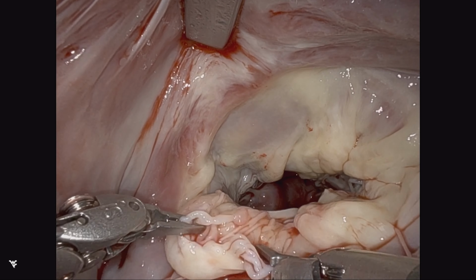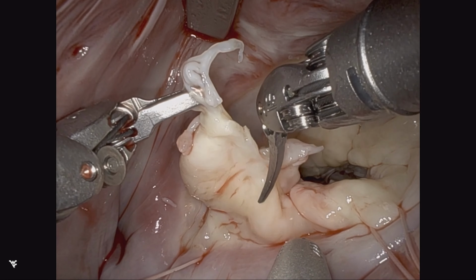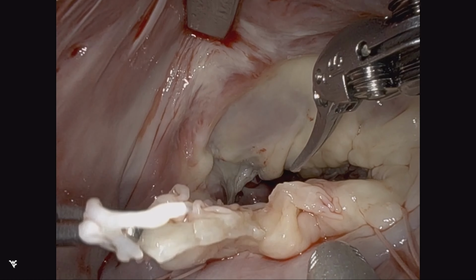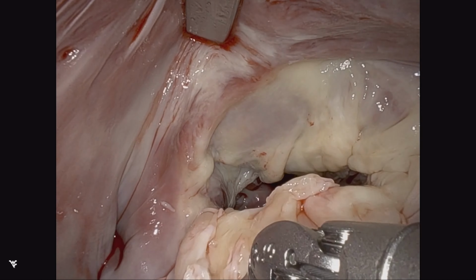But given the diffuse nature, resection is decided. Initial triangular resection is performed. You can see that this little middle segment is likely going to have to go as well.